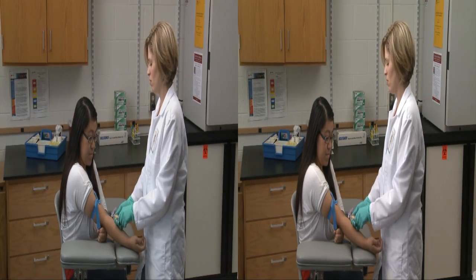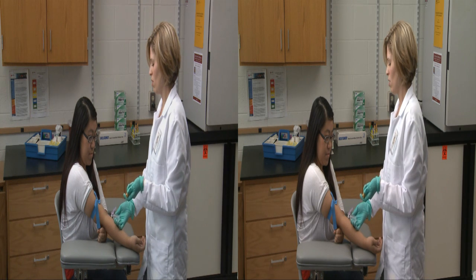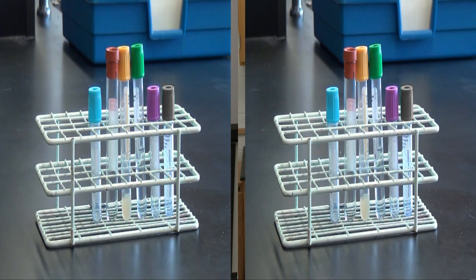Removing the tourniquet allows the blood to return to its normal rate of flow through the vein and helps reduce bleeding at the puncture site. When performing a multi-tube draw, it is important to follow the correct hospital-mandated order of draw. Blood cultures are always drawn first. However, in a routine venipuncture, a light blue tube should be drawn first, followed by a red top, gold, green, lavender, and gray.